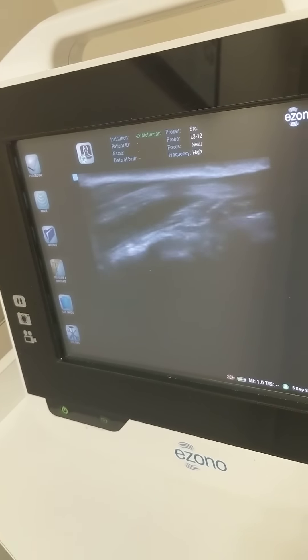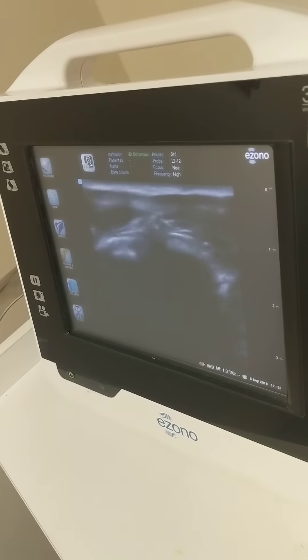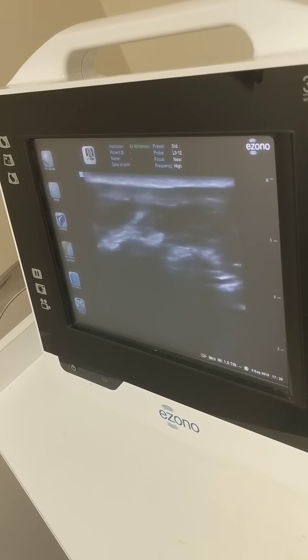We're going to put the needle in the area that I already numbed. I hate needles, by the way, and it's painless. We already numbed up the area, and then we're going to watch on the video. Go! Thank you.